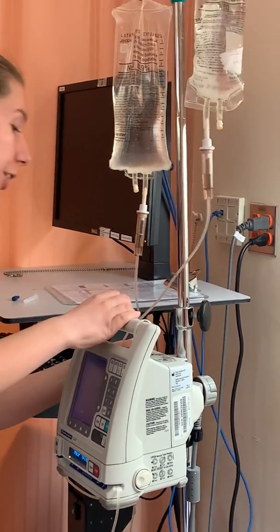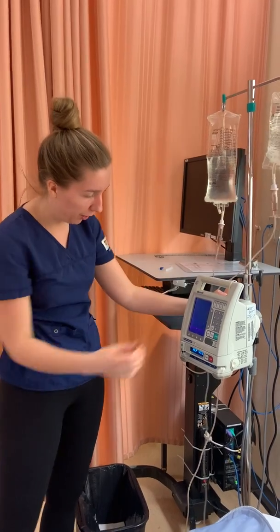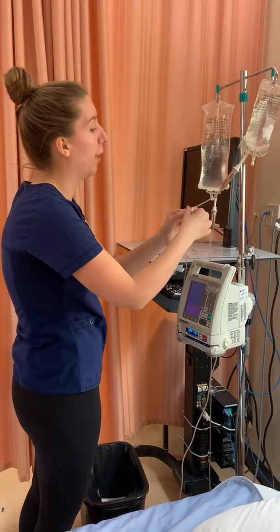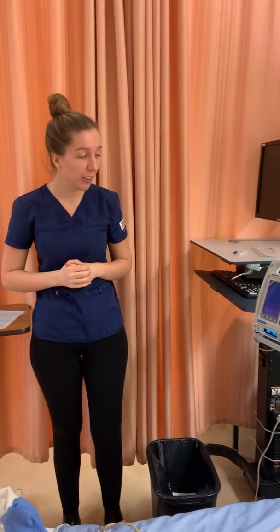I'm now going to lock the channel. I've locked the channel. And I'm also going to put my patient's label on their line so people are aware of when I prime this tubing. So it has the date, the time, and my initials on it. So after setting this all up, I'm now going to do my safety check before I leave.